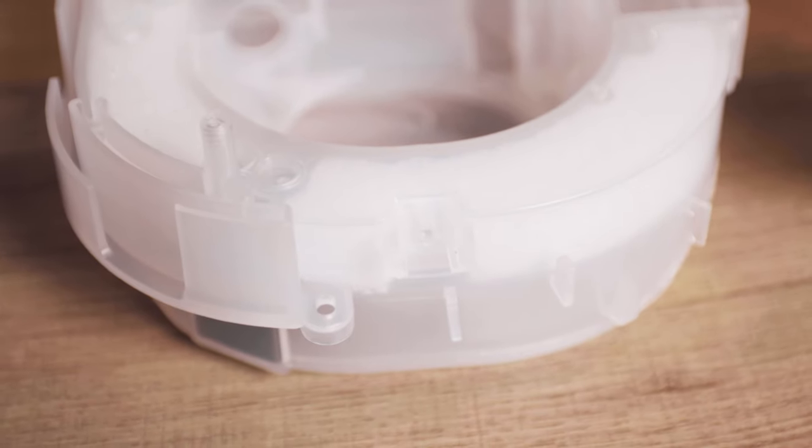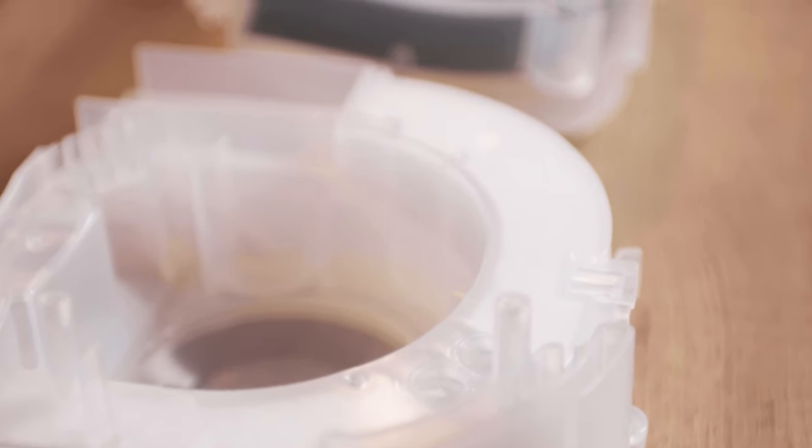Their small body means that there is no room for sound abatement foam, and because they often have smaller motors, these motors have to work a little harder to produce the air pressure required. Quite honestly, the difference in sound is minimal with the AirMini. This is still a very quiet machine, and I've heard next to no complaints about the sound level from users who use this device regularly.